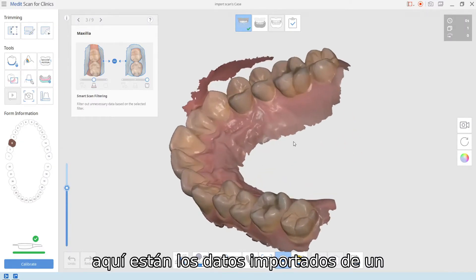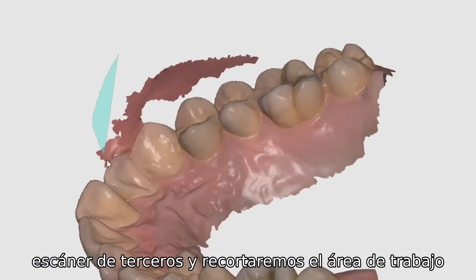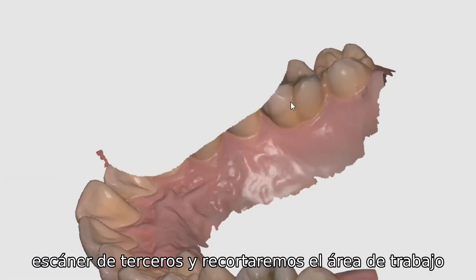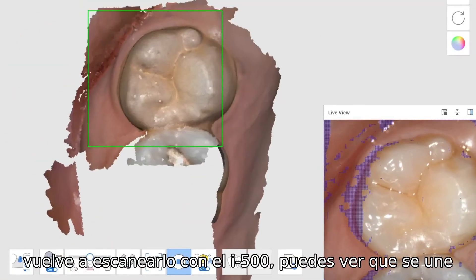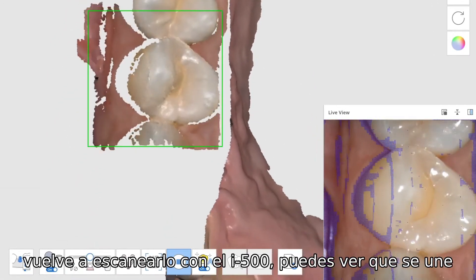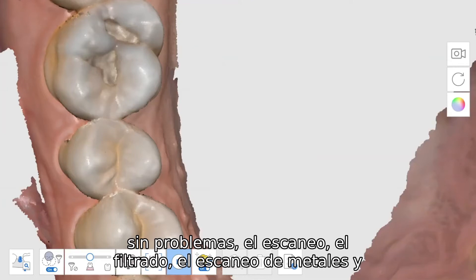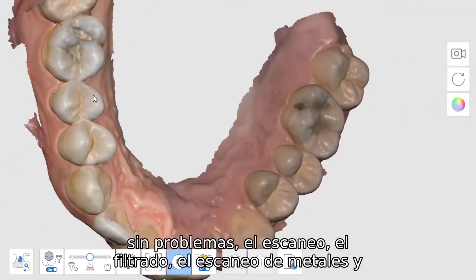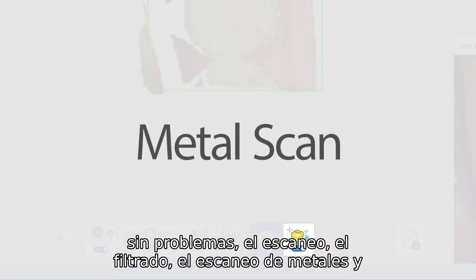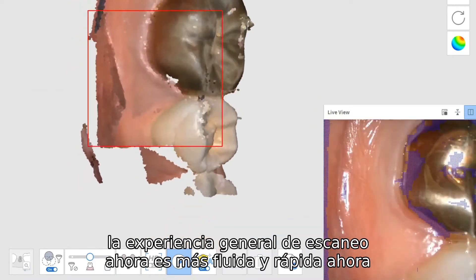Here's the imported data from a third-party scanner. We'll crop out the area you're working on and re-scan it with the i500. You can see it stitches together seamlessly. The scan filtering, metal scanning, and overall scanning experience is now smoother and faster.